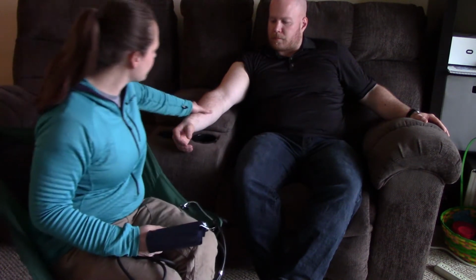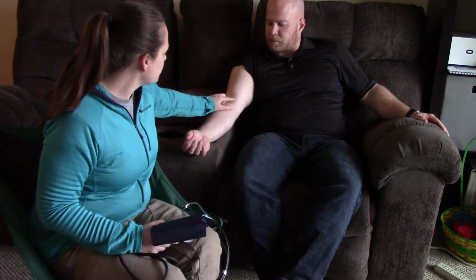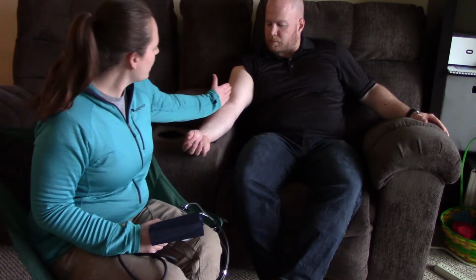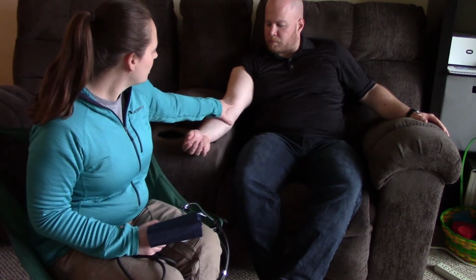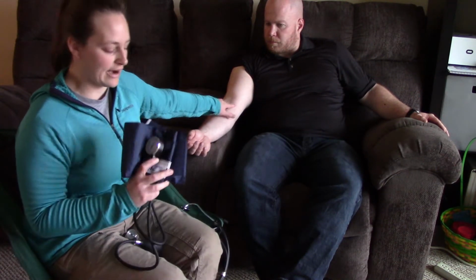So if you sort of hyperextend your arm, you probably might not be able to see it on the video, but typically you can see a small blue vein medial on the arm. So not right in the middle, but more towards his trunk. So over on this side, you'll see a blue vein, and that artery is going to be right next to there. And that's where we want that arrow to be pointing.